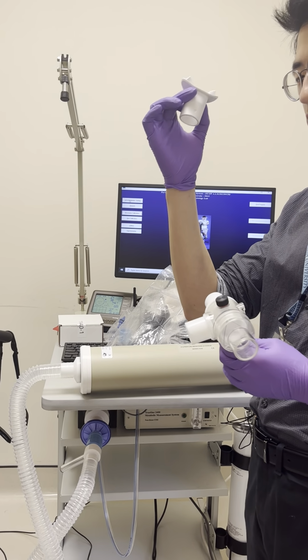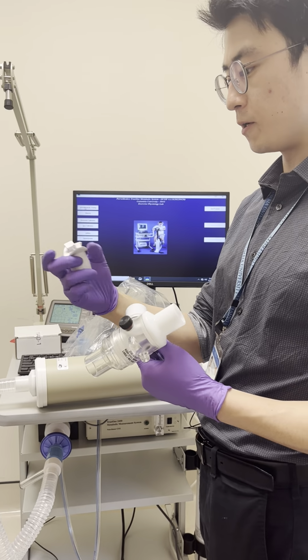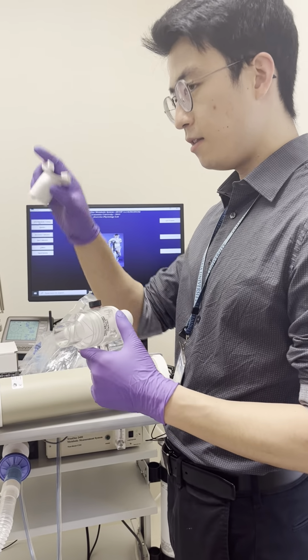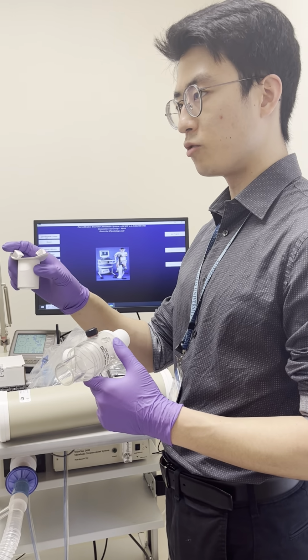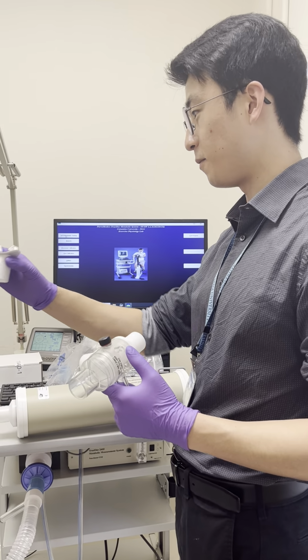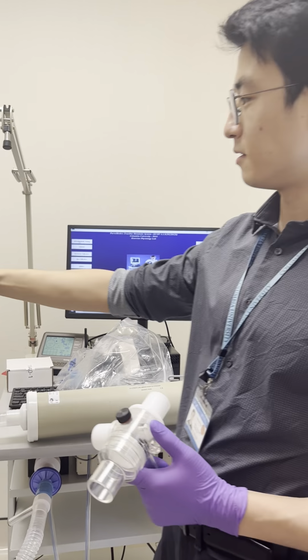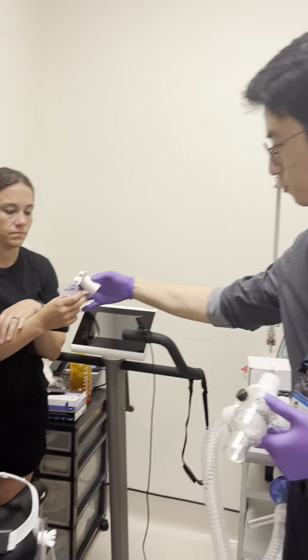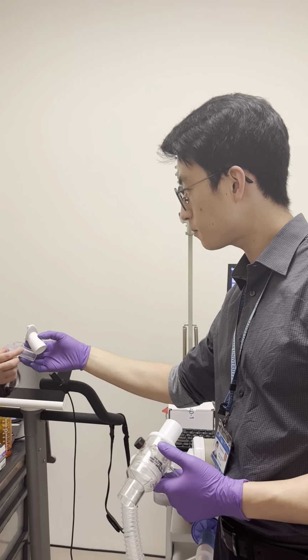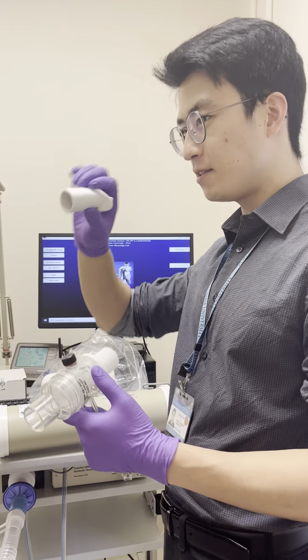The other part you need is a mouthpiece. This is what the patient will actually be biting down on. I have several of these here. These are the ones produced by Medical Graphics, and they're more comfortable, I think, than that thing right there. I mean, that's pretty big, right? If you just hold them up, this is much easier to bite down on. The problem is that the opening is a little small.